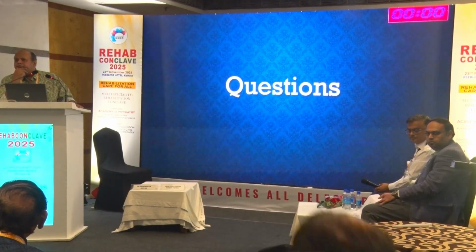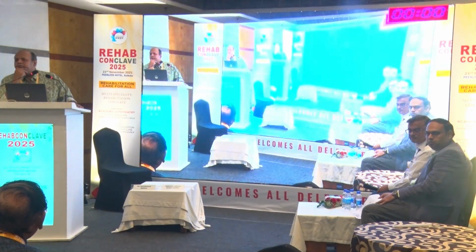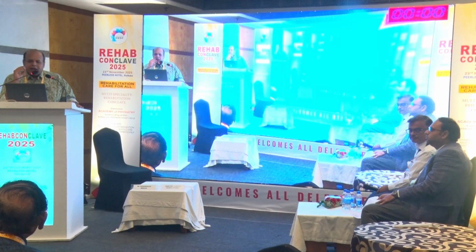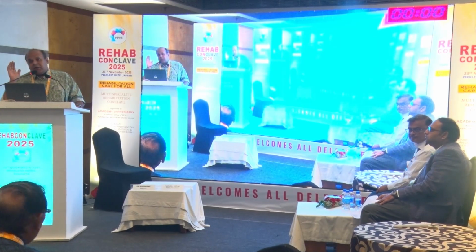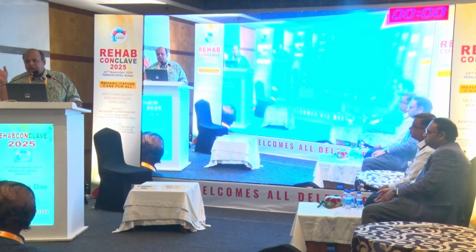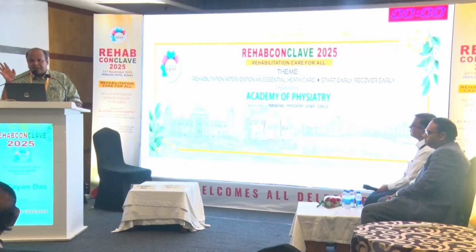Sir, osteoarthritis shoulders, like in frozen shoulder, what do we go for as an investigation? Is it USG, HR USG or MRI? Which would you prefer considering the cost involved? It's always a USG with a dynamic movement that gives you the story about impingement and the bursal status.